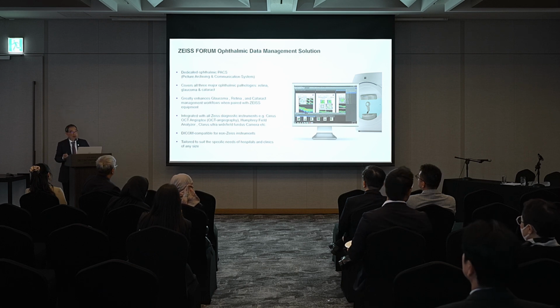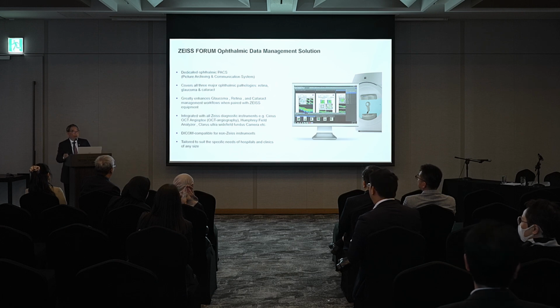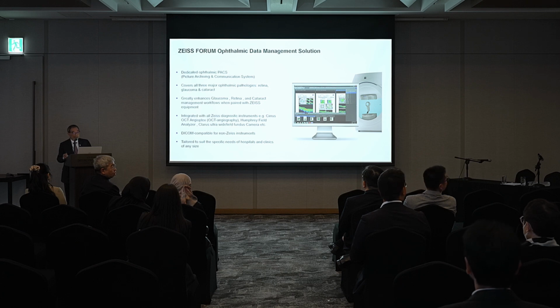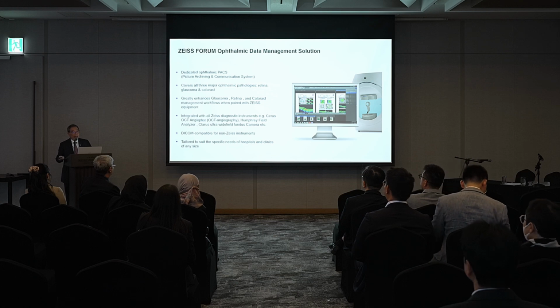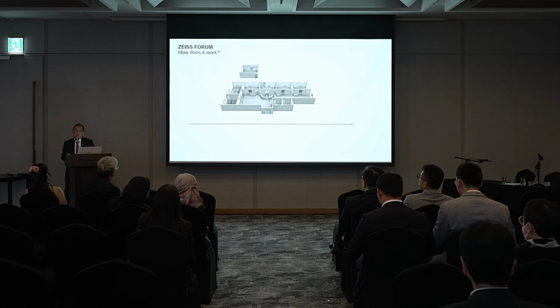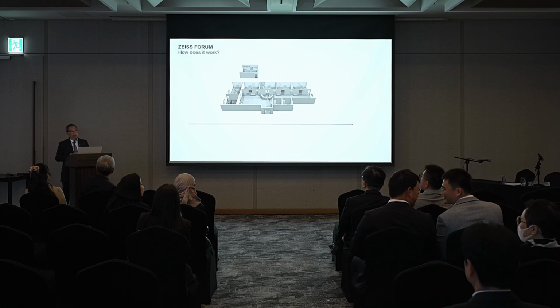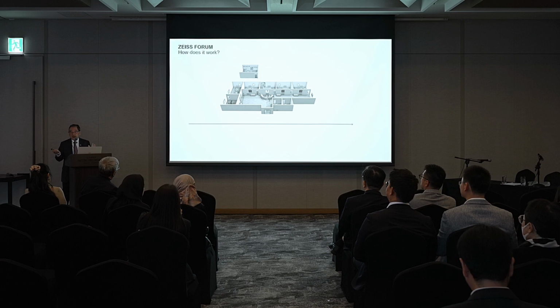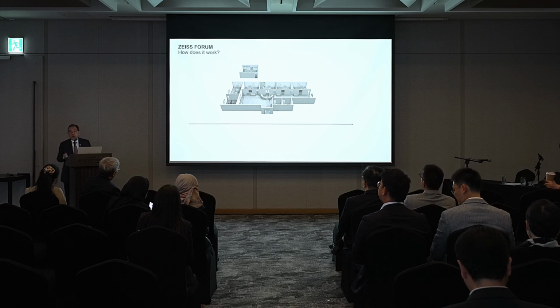We have been waiting for something like this for a long time. Individual vendors have been trying to come up with a suitable system with thumbnails and so on. But I think that this is the first most practical application of this. It is very relevant for us in glaucoma and retina and in cataract. Of course, the limitation is that it works only on Zeiss machines. You can pull in other images, but they appear as thumbnails, right? And they are sort of PDF type of images. So you can't analyze if you have pulled in an image using non-Zeiss equipment.